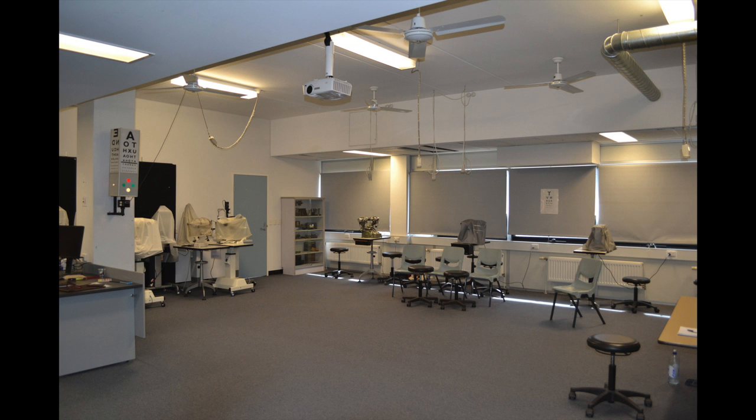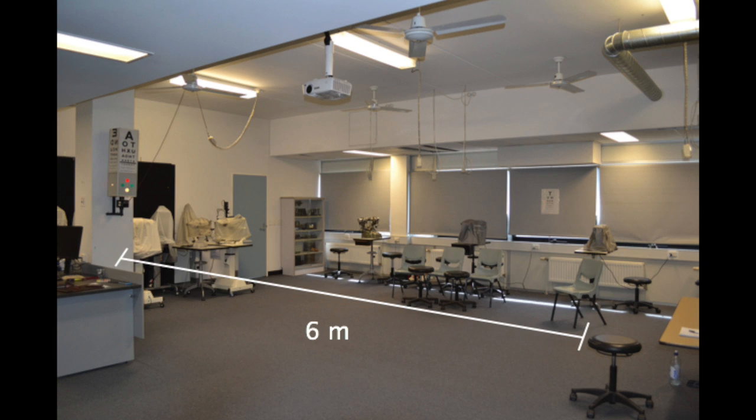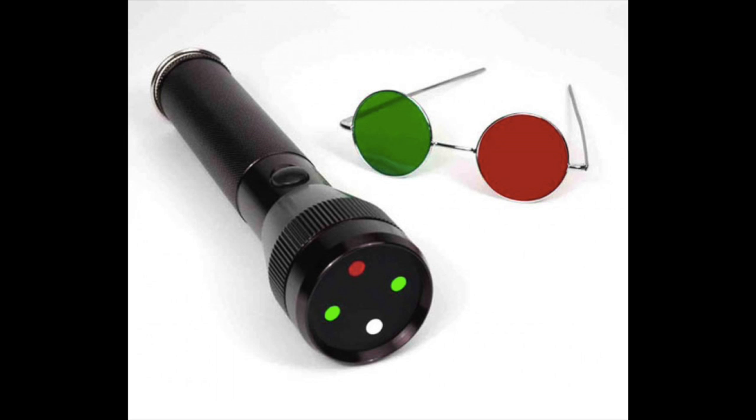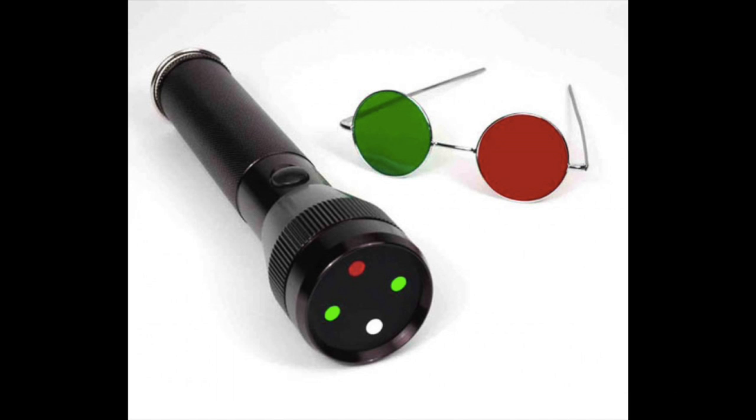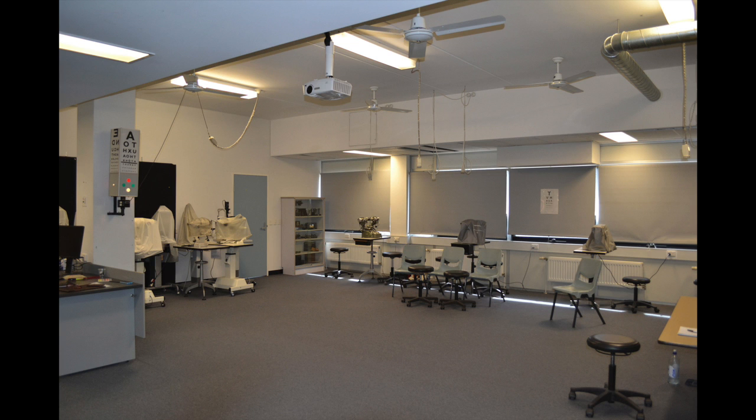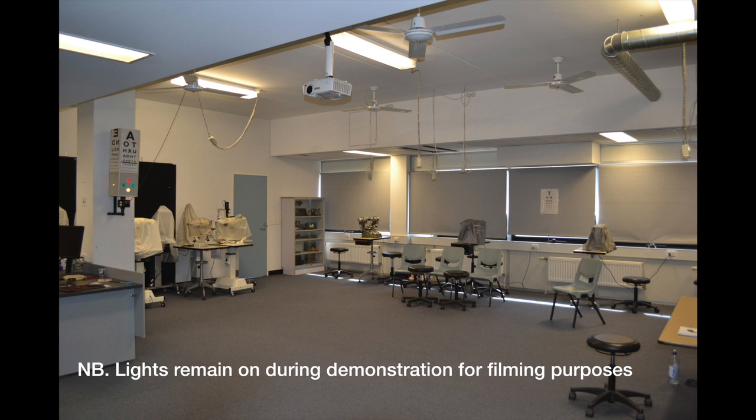In this video, you will see the test being performed at distance. The patient will be situated 6 metres from the light source. This test can also be repeated at near, at a distance of 33 centimetres, using a specially designed torch with the same arrangement of lights. The room lights will need to be dimmed during testing; they are left on in this video for the purpose of visibility during filming.